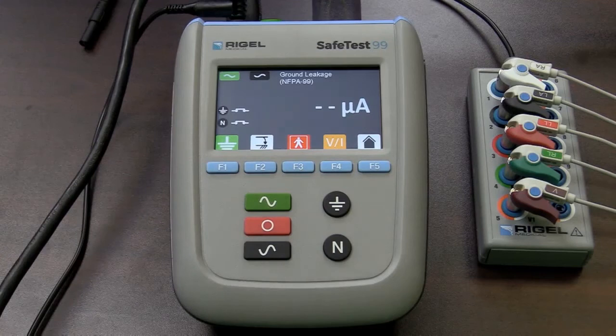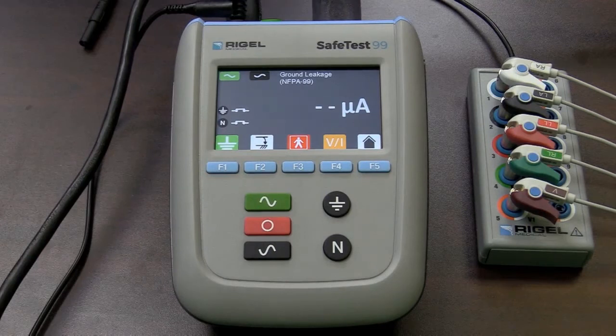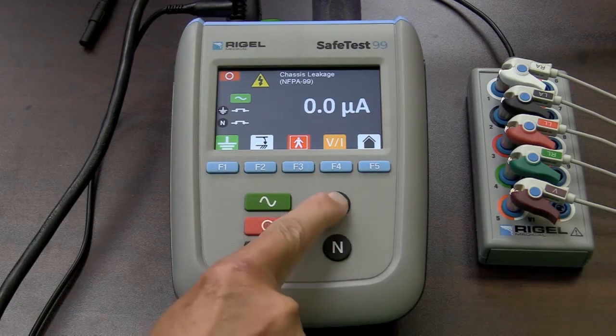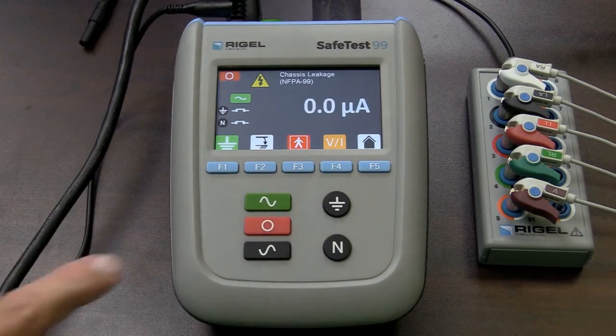I will select my leakage current measurements and put power to my device. Within NFPA 99, it has you do testing with the power switch on the device on, and also with the power switch in the off position. There is my ground leakage. I'm now going to select chassis leakage, also known as touch leakage. There is normal operating condition. I am going to lift my ground connection, and there is the leakage current for my single fault condition. And we'll close that again.